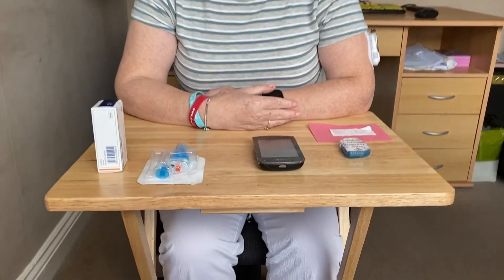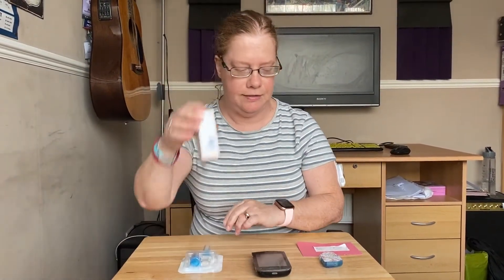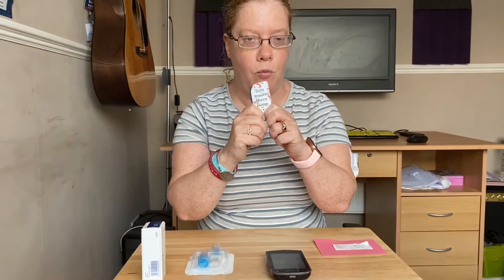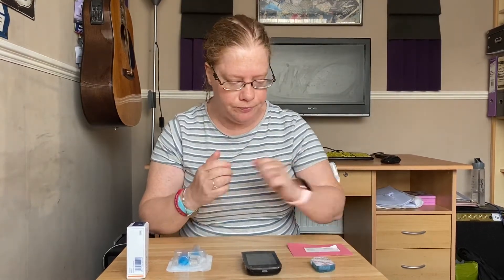Today is the day I need to put on a new pump base. I have everything I need: a new reservoir, insulin, and the new pump base which I've already decorated. When you're about two weeks away from changing your pump base, I recommend asking Roche or your usual supplier for another one, so you always have two. That way you always have a spare if something goes wrong.